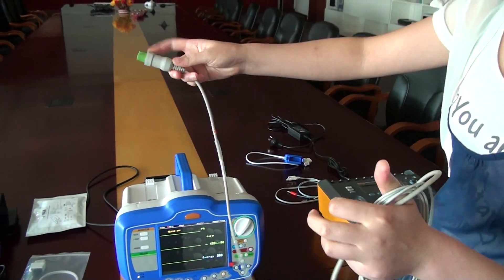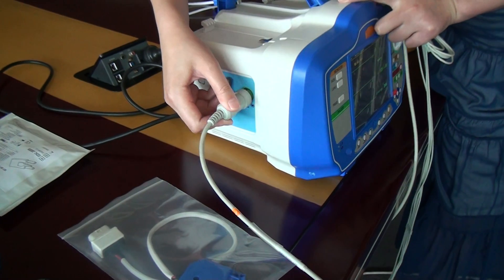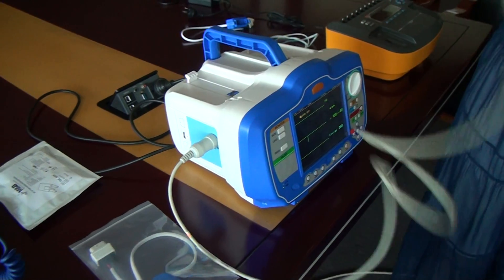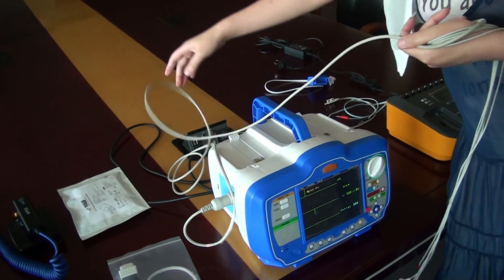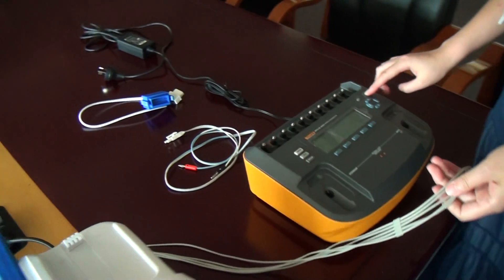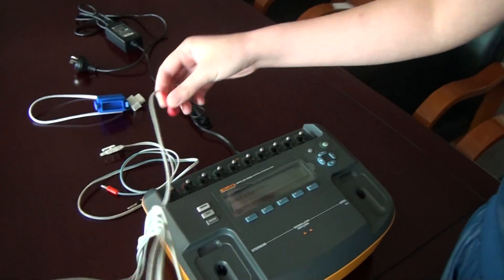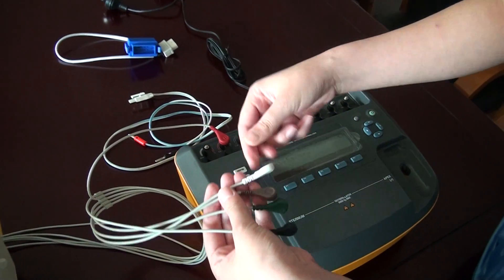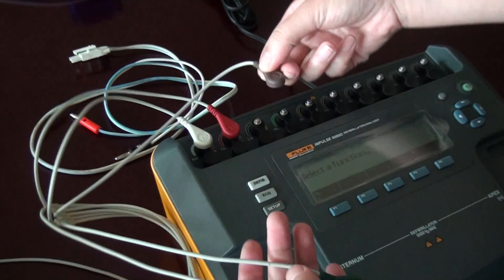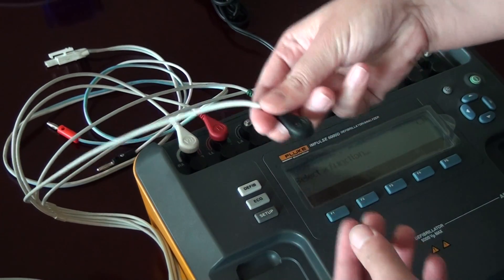Now we connect the ECG cable. We connect it: LL, RA, V, RL, and LA.